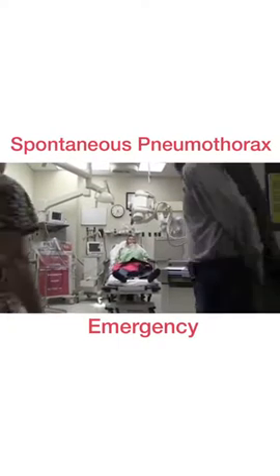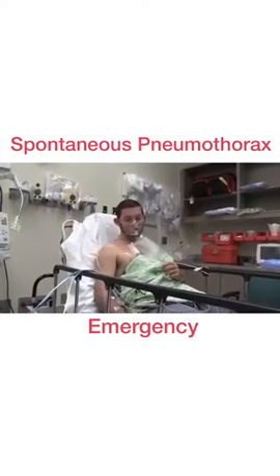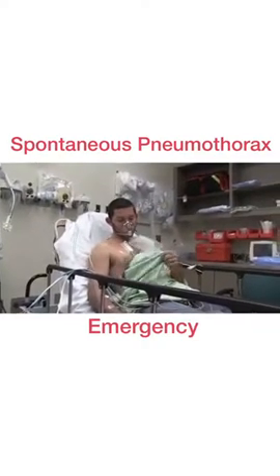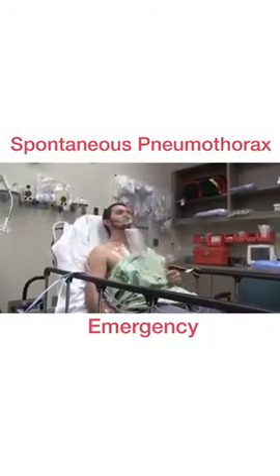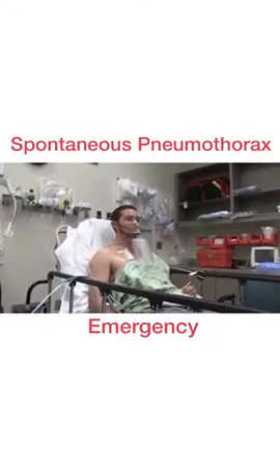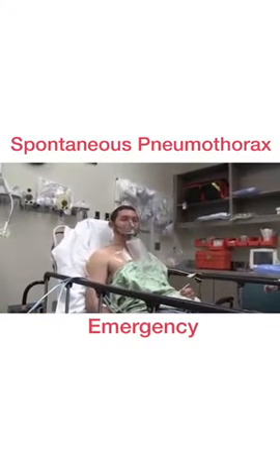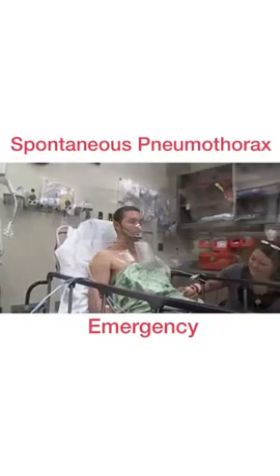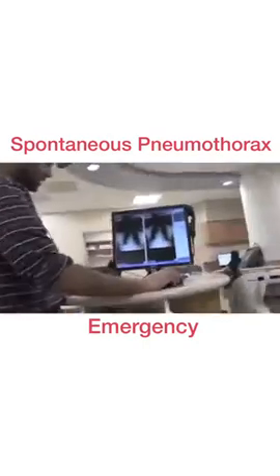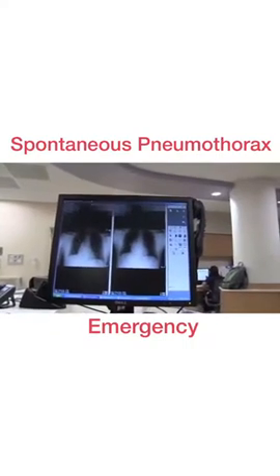You can breathe. So Patrick, on a scale of 10, how bad was the pain when that went in? 10. 10? Okay. And how long did it last as a 10? Right after you got done, it went away. Okay, so it was less than 30 seconds that you had the severe pain. Okay. So I think there's an increase in lung markings here as compared to here.